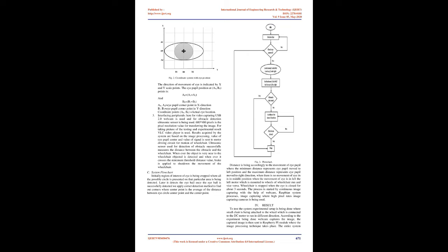This technique comprises several stages which are implemented to find the eye movement and also for face and eye detection, color switching, object tracking, Haar transform, edge detection and motion detection. Initially, the system captures an image by making use of a webcam. The first step is that the algorithm accurately detects the face of the user. If there is a greater number of faces, it displays an error at runtime. According to the algorithm, the system represents the user's face in a specific area of the indicated image.